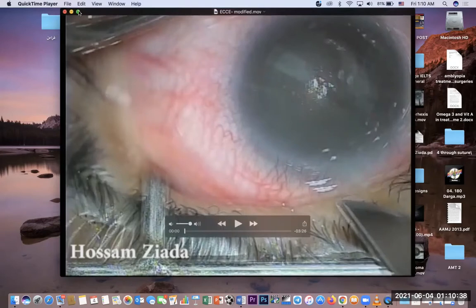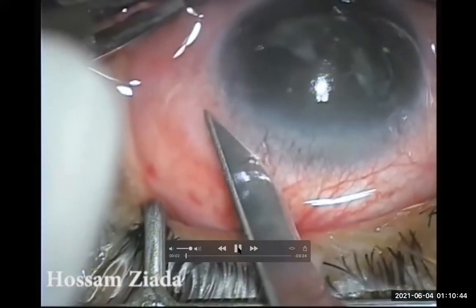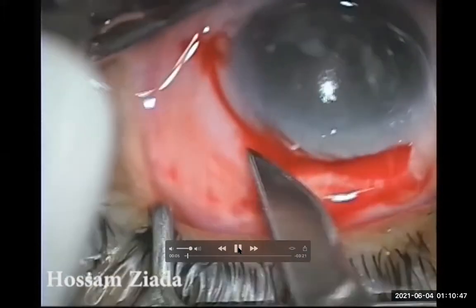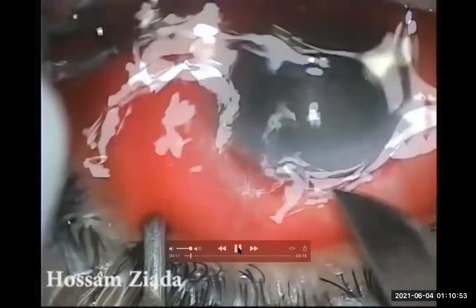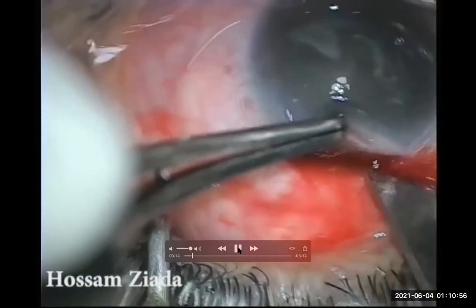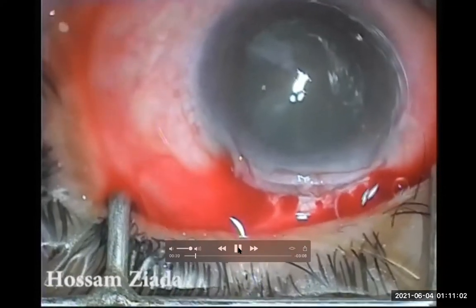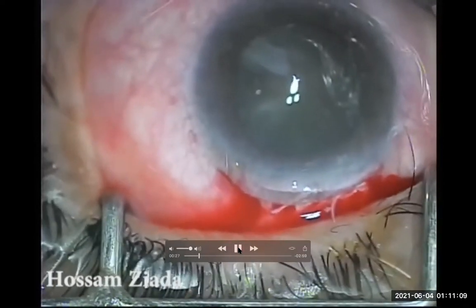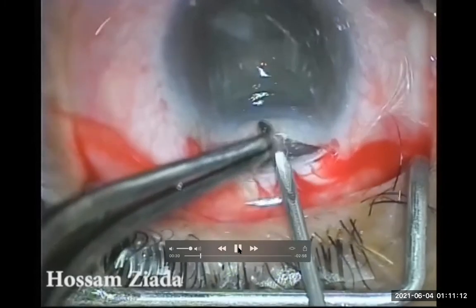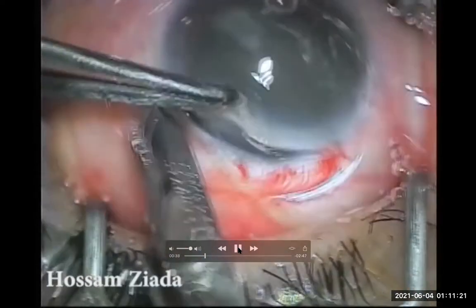So let's go for the video. I will incise the posterior limbus. This patient has extensive pannus, so I just placed my incision through the posterior limbus transconjunctivally, without the conjunctiva being incised by my blade. So I'm doing the lamellar dissection now. This is the key message of the surgery — to do a lamellar incision: a corneoscleral incision with a lamellar dissection all through the wound.